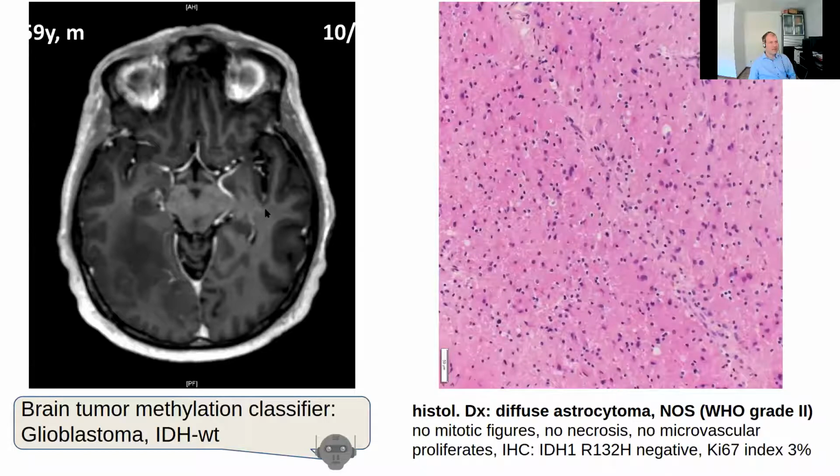I'm going to show you a clinical example of such an application. Look at this radiograph. Here you see a lesion, and this lesion, all the neuroradiologists would agree, doesn't really show high-grade malignancy. Also, histology alone doesn't really tell you much. Of course, if you would have sequenced it in depth, you might have found something, but on a standard sequencing approach at that time, you would only sequence IDH and you would not find any mutation. So you would say that's a diffuse astrocytoma and it's kind of benign.